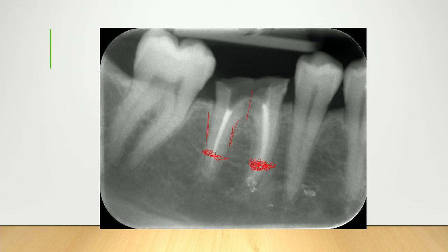If I'm able to, I actually get a straight burr and I cut the GP out of that root as well, okay? But you really need to know where you're going, okay, because your nerve is right here, okay? So if you don't know where you're going, I wouldn't recommend it. But for me, if I'm comfortable and I fractured a root and I can't get that root out and it's an elderly patient, I wouldn't necessarily make such a big effort to remove that small part of root.